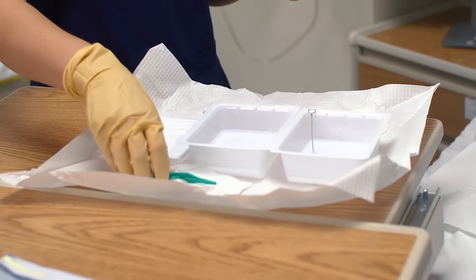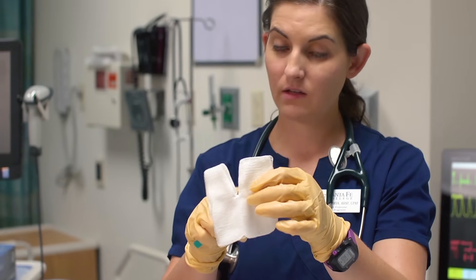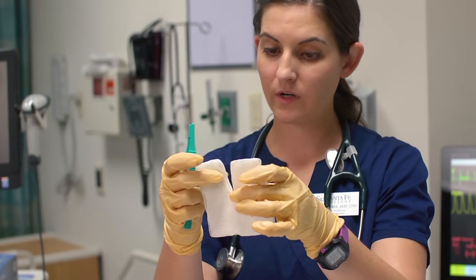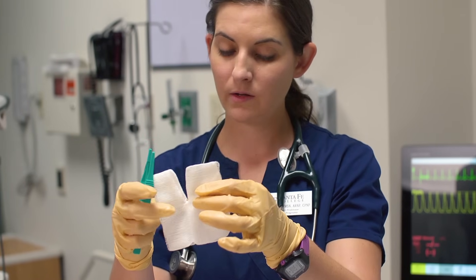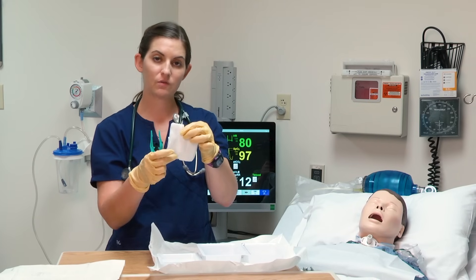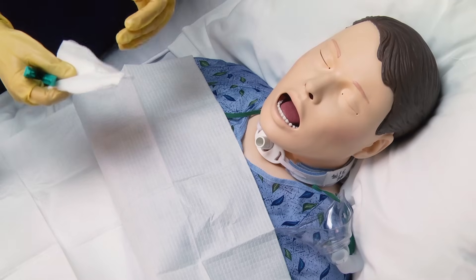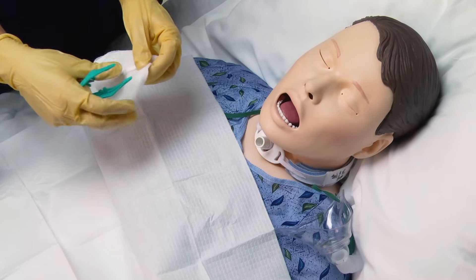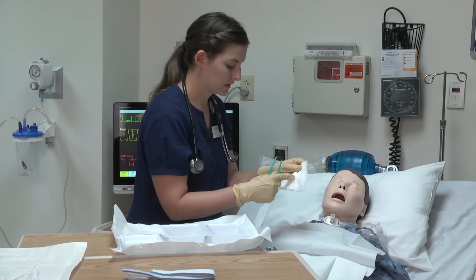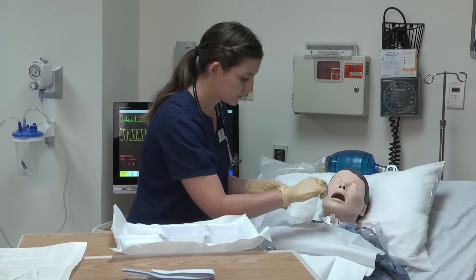Now I'm going to reach for my forceps and drain sponge. If you look at the drain sponge, it has a cut but no frayed edges, so you don't have to worry about frayed edges getting into the patient's airway. The cut slides up underneath the face plate, with the sealed part at the bottom of the tracheostomy so the skin is protected from any drainage. During this part you will become contaminated — try your best to keep the sponge from touching anything so it remains as sterile as possible around the stoma. You can use the forceps to help you reach.